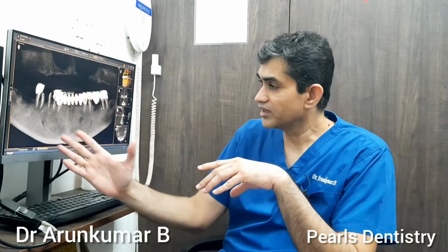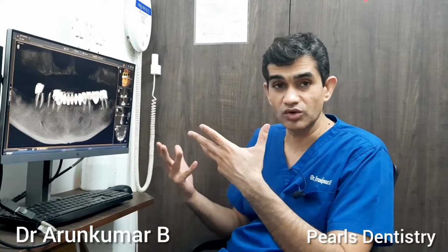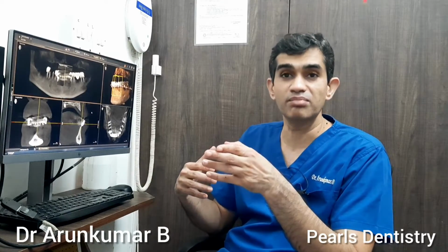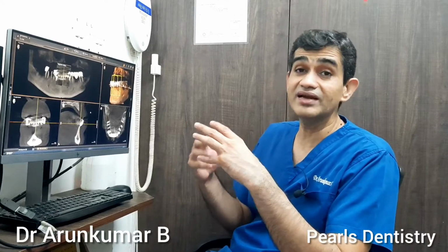The reason why we take a CBCT is this: an X-ray will show the complete jaw in entirety. Looking at this X-ray, it shows that there is enough bone, but we won't be able to decide, in the place where we actually do the implant, whether there is enough bone in terms of height, width, and quality. What is the amount of bone? It will be very difficult to predict looking at a two-dimensional X-ray.